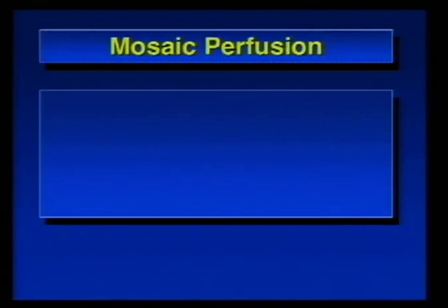Why would that occur? Why would you get poor perfusion in certain parts of the lung? Well, there are two causes. One cause is small vessel disease. And what types of small vessel disease cause poor perfusion? Well, most commonly, chronic PE, chronic thromboembolism, can cause small vessel disease and mosaic perfusion. What do I mean by mosaic perfusion? Poor perfusion of certain parts of the lung, and that manifests on a CT scan as dark areas. So they're patchy, dark areas on the CT.